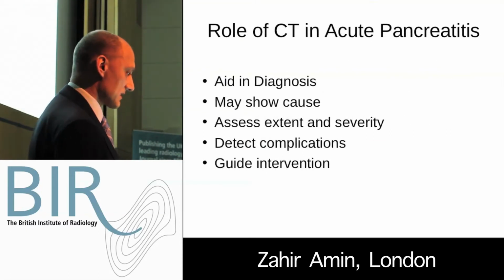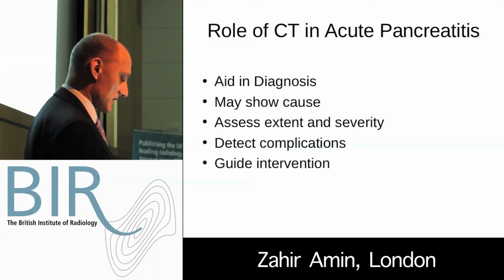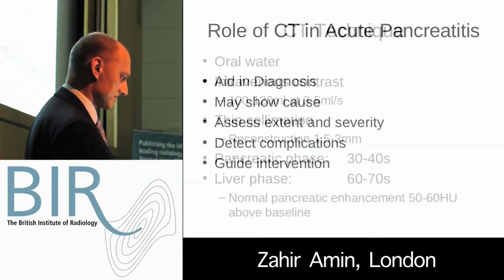So the role of CT in acute pancreatitis: aid in diagnosis. It may show the cause of the pancreatitis, the gallstones, or chronic pancreatitis. It helps in assessing the extent and severity of the inflammation and necrosis. It picks up complications and also guides intervention.